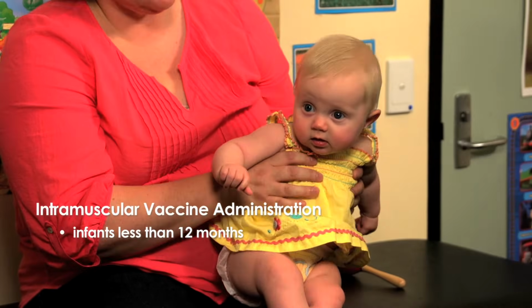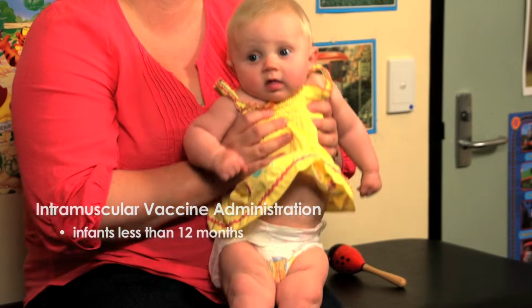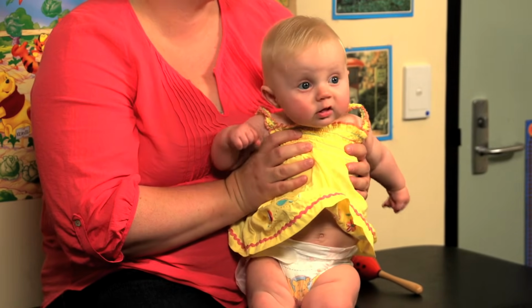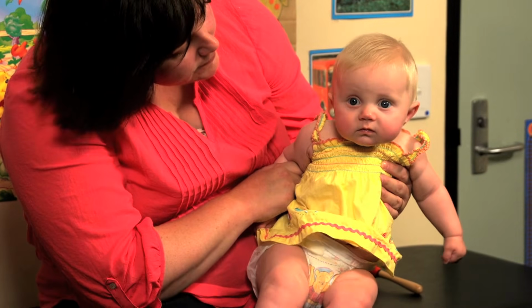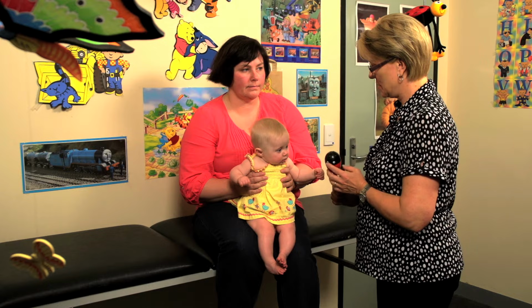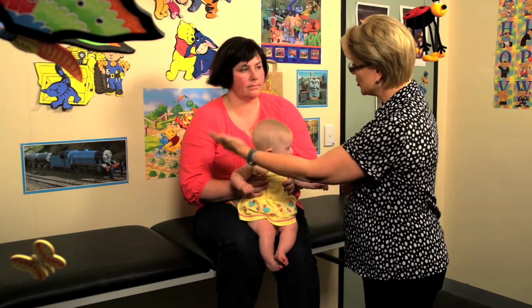This infant is presenting for her 4-month vaccinations and will be receiving 2 intramuscular injections, 1 in each vastus lateralis muscle. This is the preferred site because of its larger muscle size. In this section, we will demonstrate 1 needle in each site. Later, we will show you how to administer 2 injections into each site.